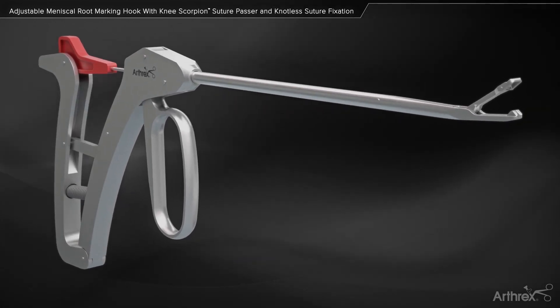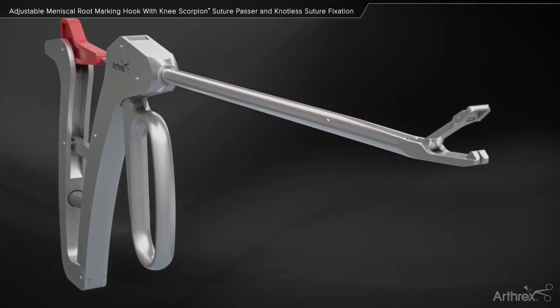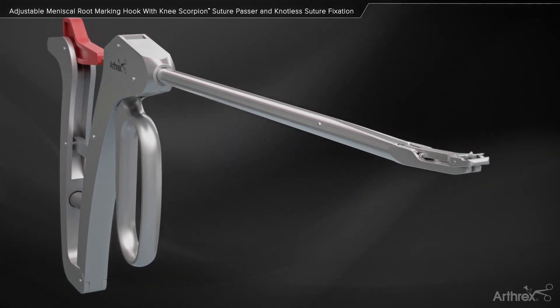The Arthrex Knee Scorpion simplifies meniscus root repairs using fast pass suture passing and retrieving technology.